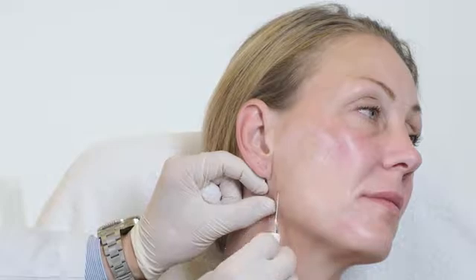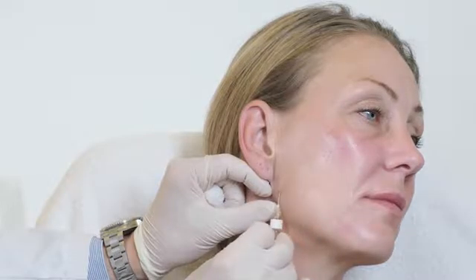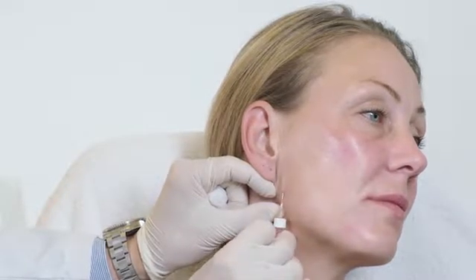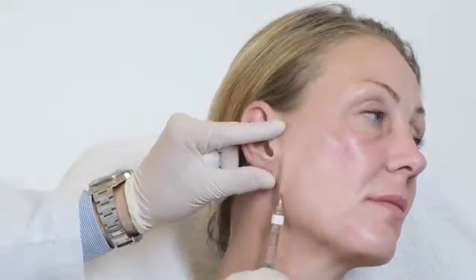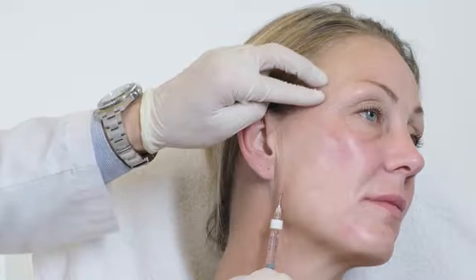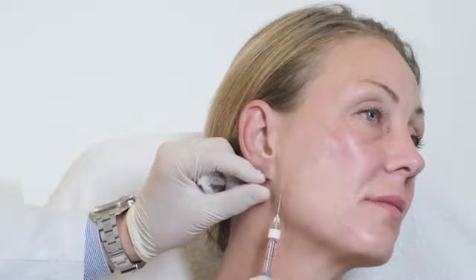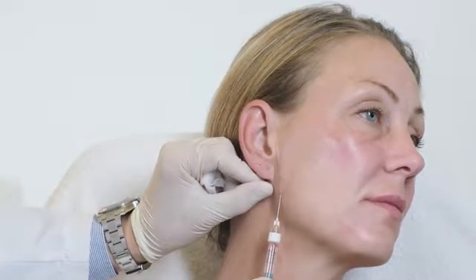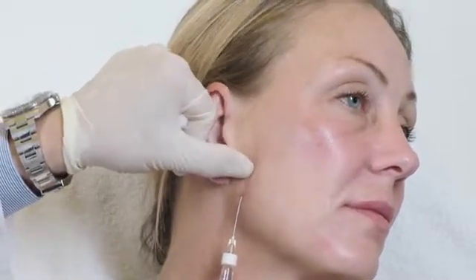The first step is to insert the cannula and go along the posterior aspect of the mandible. This is an area where we have a lot of ligaments. The most convenient way to pass them by is to just roll your cannula through. Make sure you're still in a rather superficial plane. This is the plane of the temporal lateral cheek fat pad, which is widely lost in Emmy's face, and then with low pressure and low extrusion force, I inject some Restylane into this area. I smooth the product with my finger, making sure I have an even distribution.